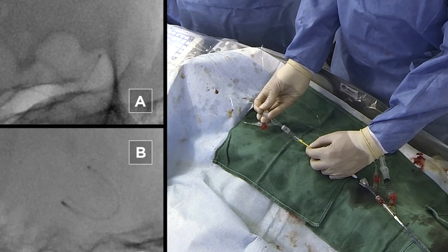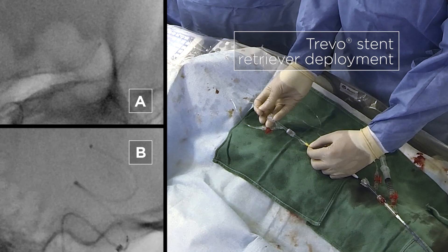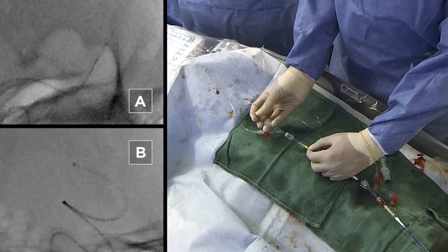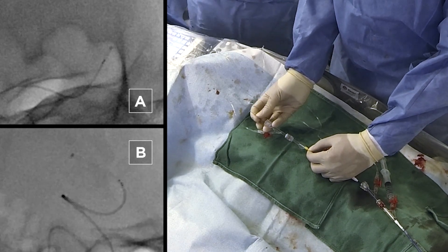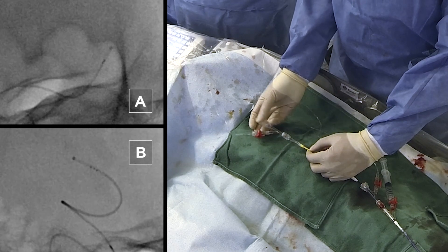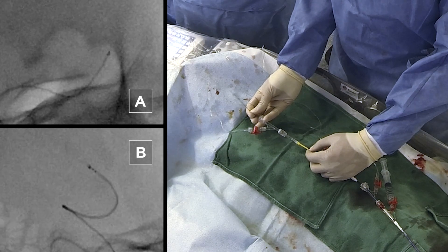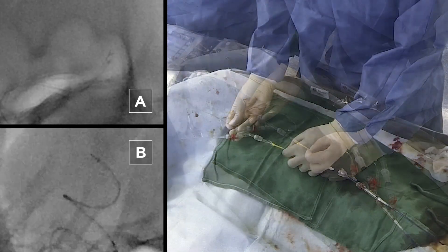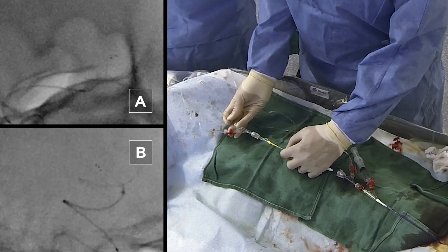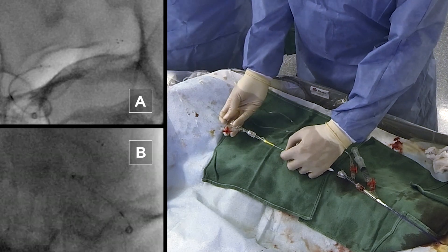Here you can see the deployment of the stent retriever. The micro catheter is still in the inferior trunk. We pushed the stent retriever towards the tip of the micro catheter — it's a long stent retriever, a 4x30 Trevo. We unsheathe the distal part and then start pushing with the wire, applying the push-and-fluff technique. You can see it is fully deployed in the carotid and the M1.